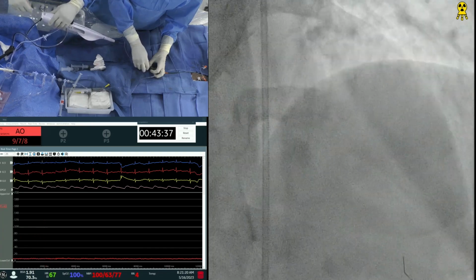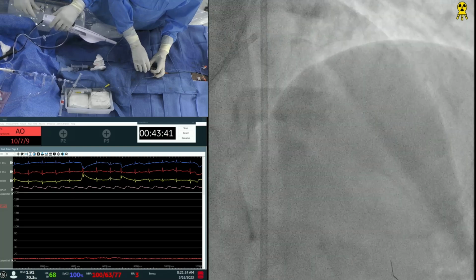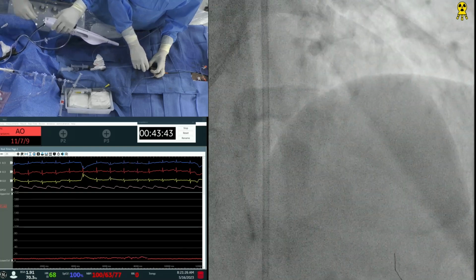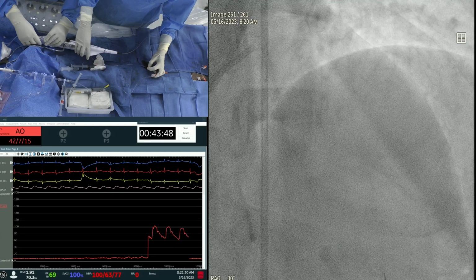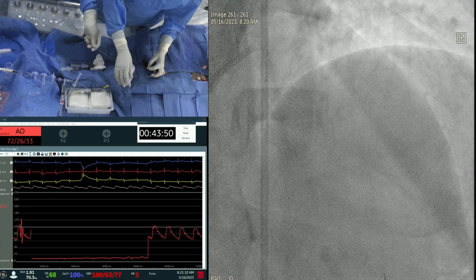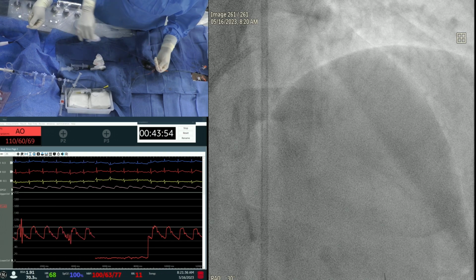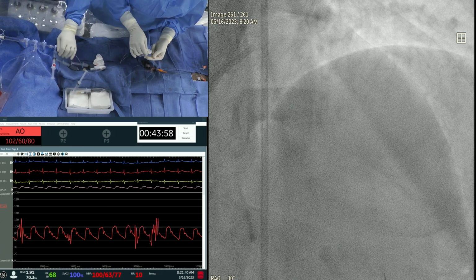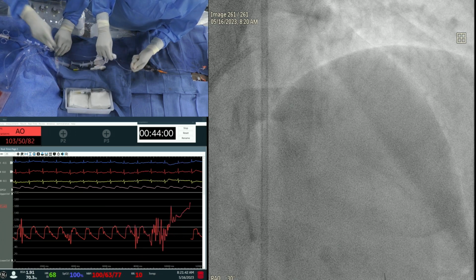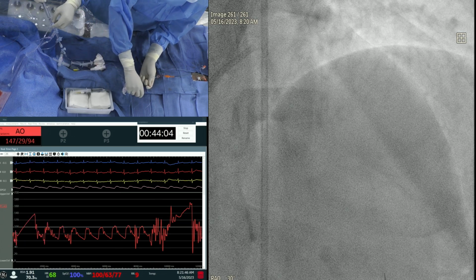And more important now, how is the diagonal? Is it still there or not? Answer to me before even taking a picture that it's still there. It will be there. It's there. I would have expected some EKG changes had it not been there. Right. It's a fairly large size, but hemodynamics have been just fine. Let's take a picture now.